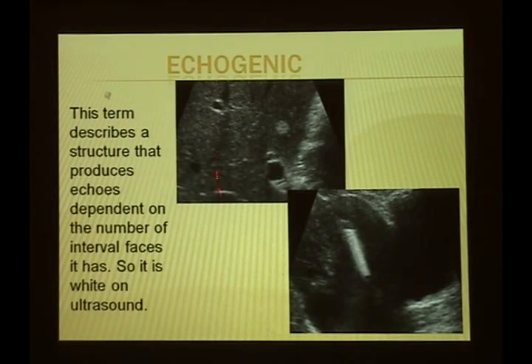This is a slide of the liver, and within the liver we have this small rounded white structure which is an echogenic lesion within the liver. This was a liver hemangioma. A female pelvic ultrasound, the urinary bladder is providing us with the acoustic window to look at the uterus, and within the uterus in the center of the uterine cavity we have a white longitudinal linear lesion which is an IUCD in the endometrial cavity. So that IUCD is looking white and is known as echogenic.